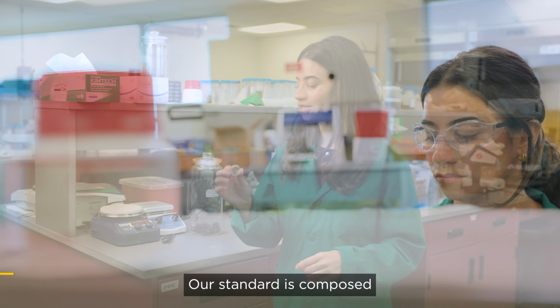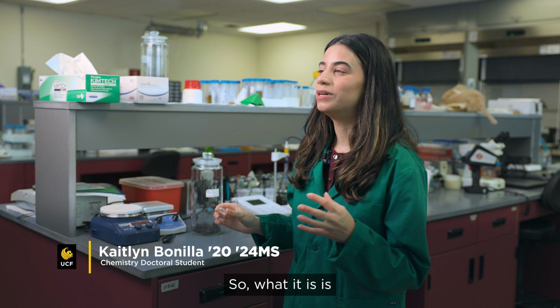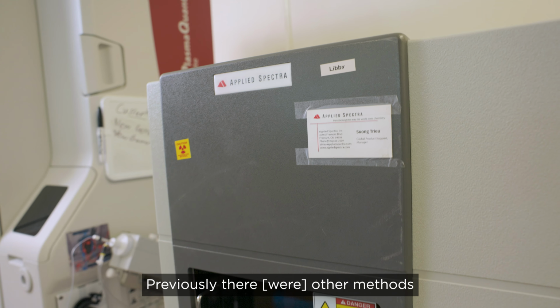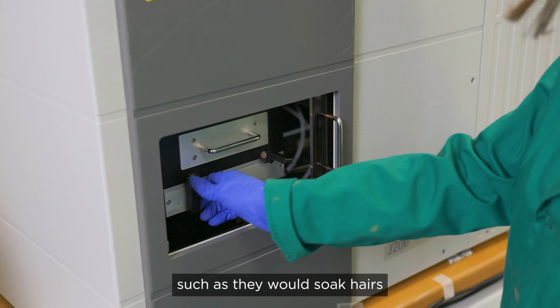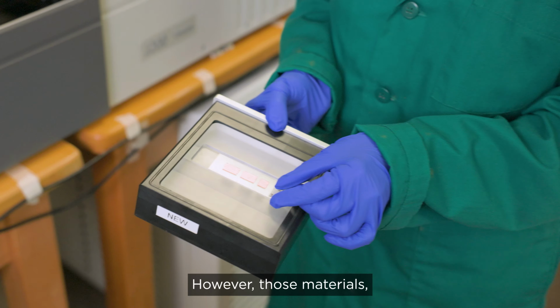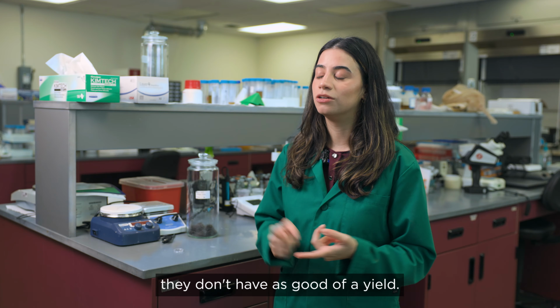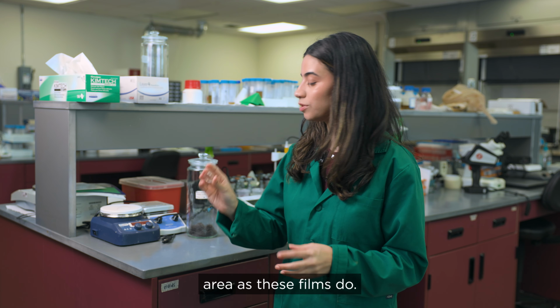Our standard is composed of a keratin film. It's this really small little material here. So what it is, we extract the keratin from human hairs. Previously, there were other methods where they tried to develop standards, such as soaking hairs in a solution of drugs or metals. However, those materials don't have as good of a yield. They don't have as much surface area as these films do.